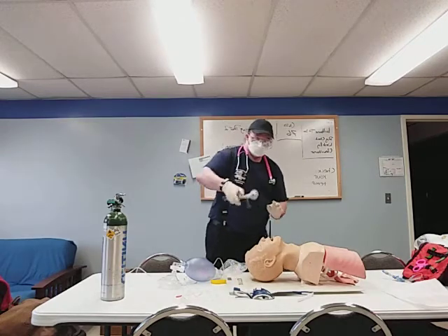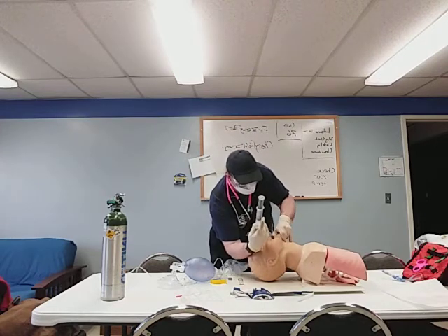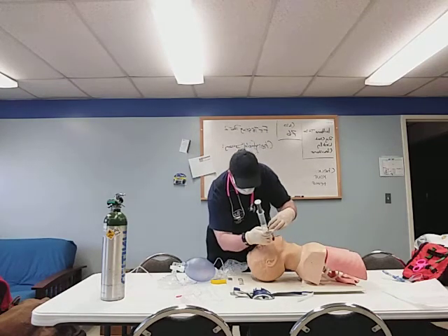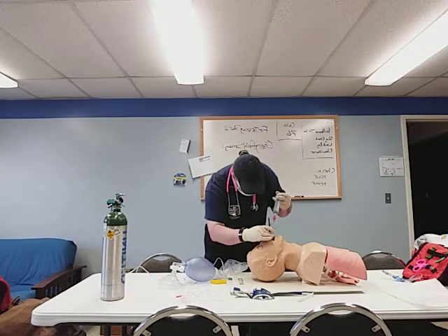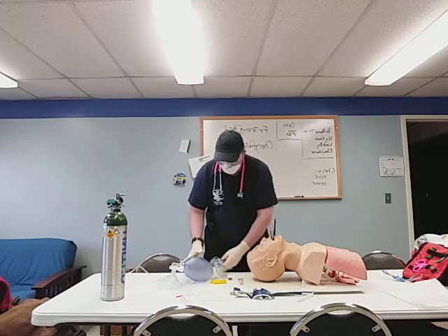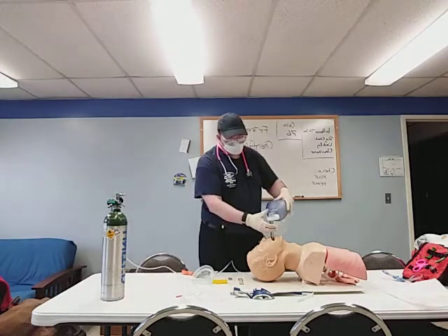So here I am. I'm going to do a chin lift, tongue lift, and jaw lift maneuver to place that, and it just went in pretty easily. I believe I have proper depth. I'm going to inflate the balloons and immediately remove the syringe and remove the mask from the bag valve.